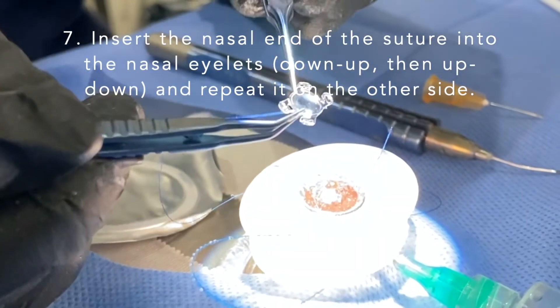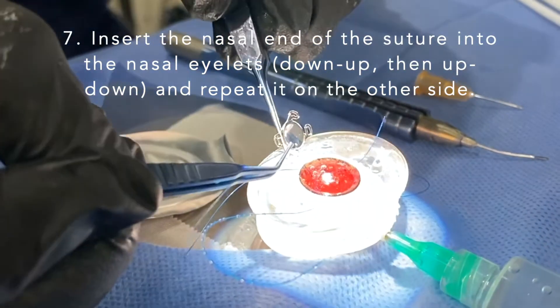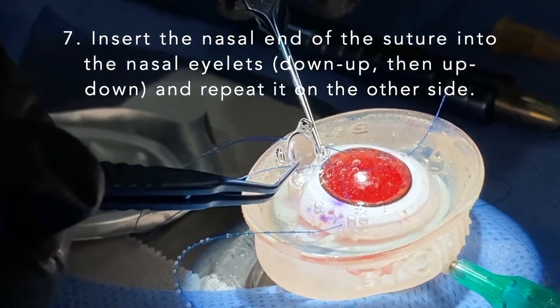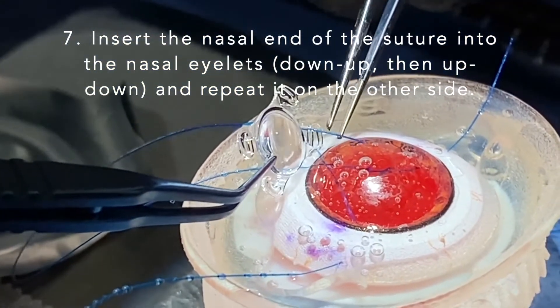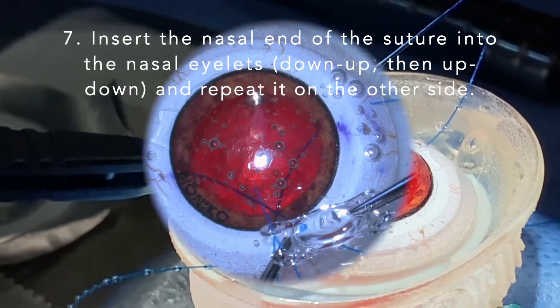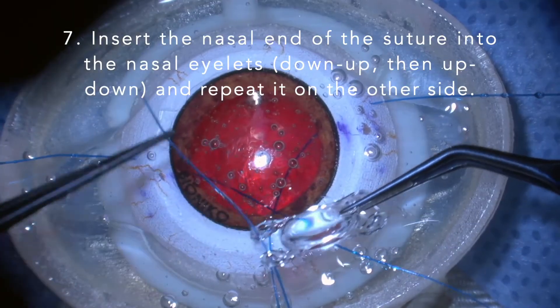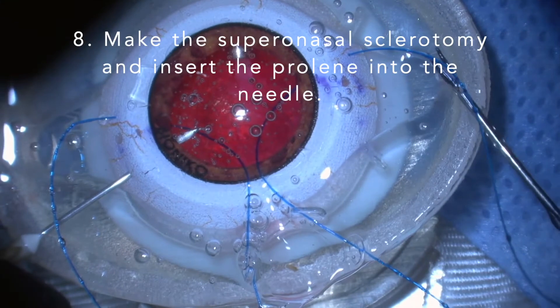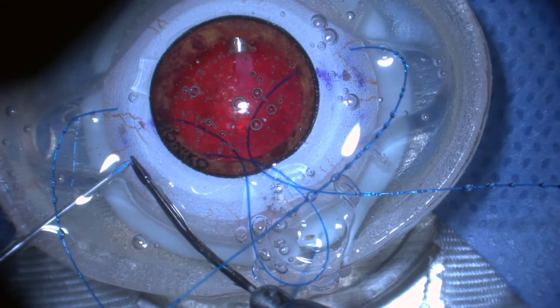Insert the nasal end of the suture into the nasal eyelets from down to up, then up to down, and repeat it on the other side. Make the first superior sclerotomy and insert the proline.